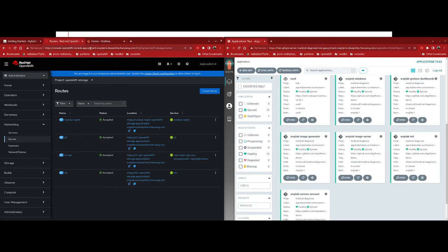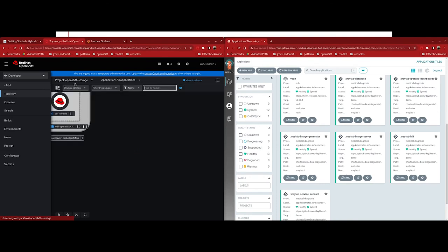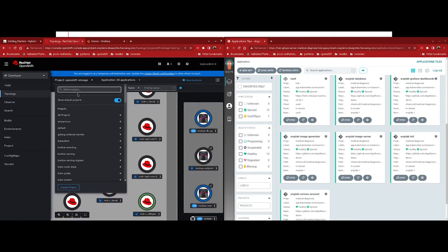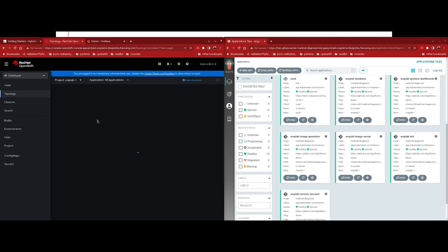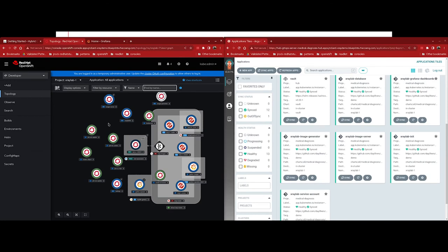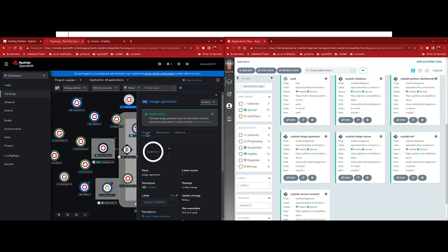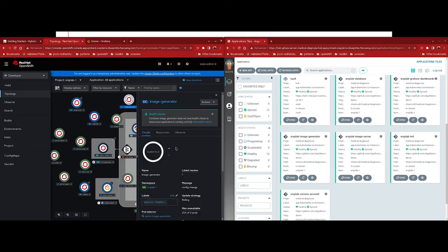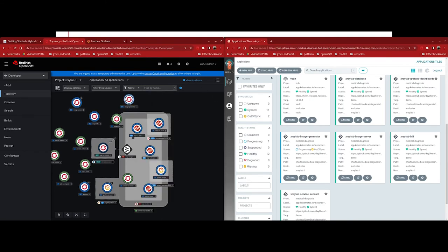And then we're going to jump back over to the OpenShift console and then go to OpenShift storage under projects. And here we have to accept the route or the security warnings for the S3-RGW route. And that's because this is actually where the images within the cluster are coming from. Once we accept the warning for this route, then we'll see some XML and we'll know that the service is good to go. So let's jump back over to our OpenShift console. And next, what we want to do is we want to go back over to our developer context and go back and look at that topology again. And now let's take a look at the image generator deployment config. The image generator application is what's actually pulling the images from AWS S3 into our cluster on that object store or into our ODF. Now, by default, the pods are set to zero because this is essentially simulating an x-ray machine. So we're not constantly going to be taking x-rays. We're only going to scale up when we need to.